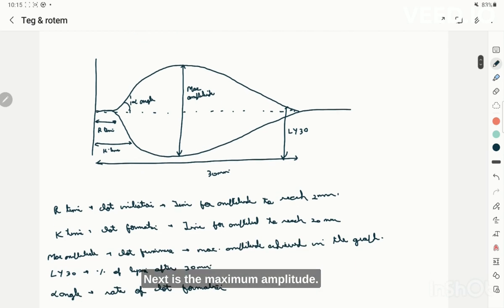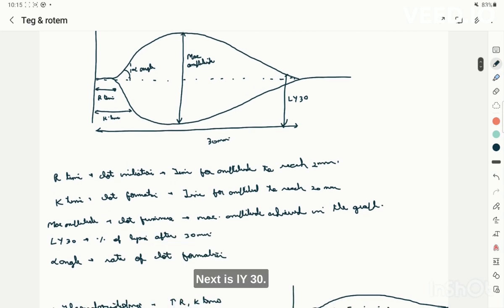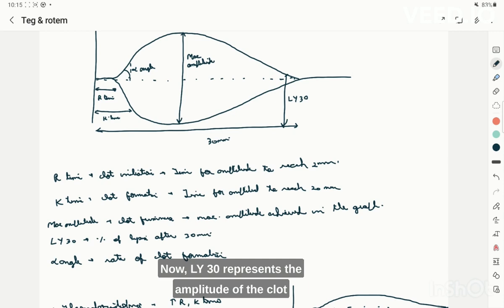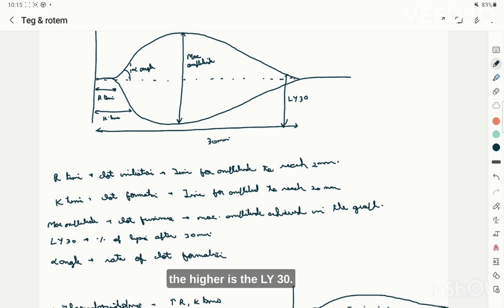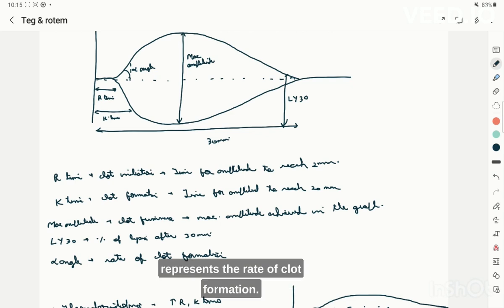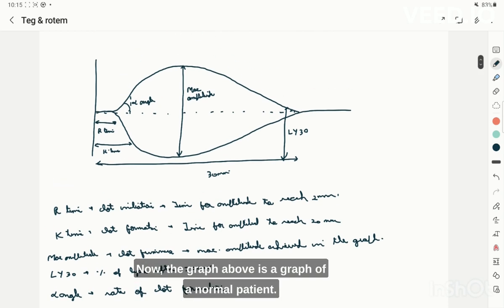Maximum amplitude represents clot firmness — the higher the clot firmness, the higher the maximum amplitude. Ly30 represents the amplitude of the clot at 30 minutes and reflects fibrinolysis — the greater the decrease in amplitude, the higher the Ly30. The alpha angle represents the rate of clot formation. The graph described so far is that of a normal patient.